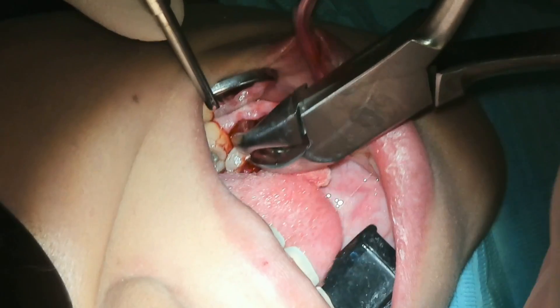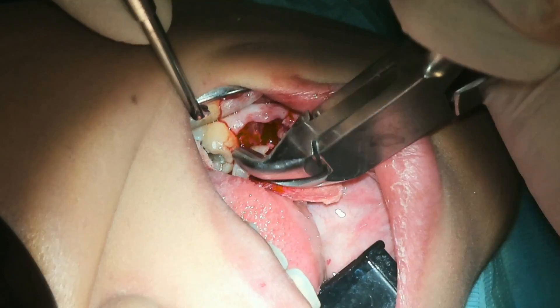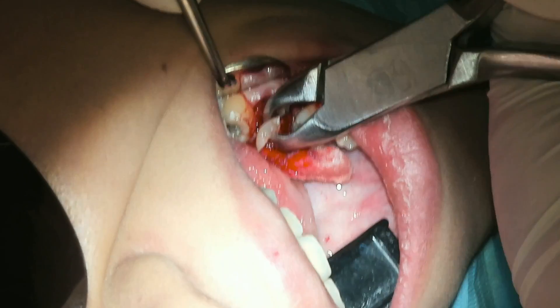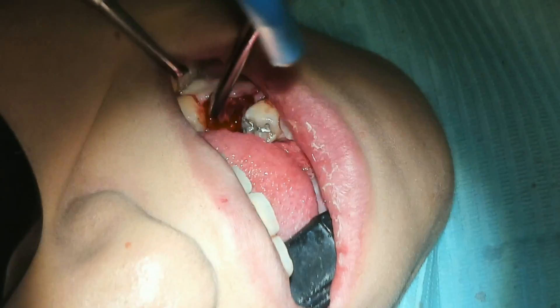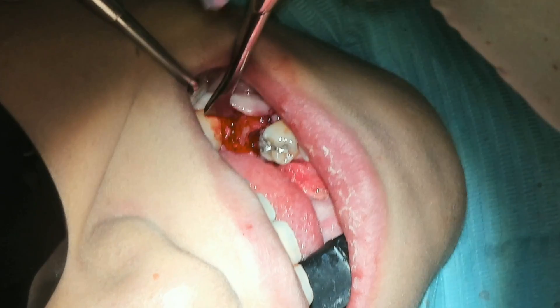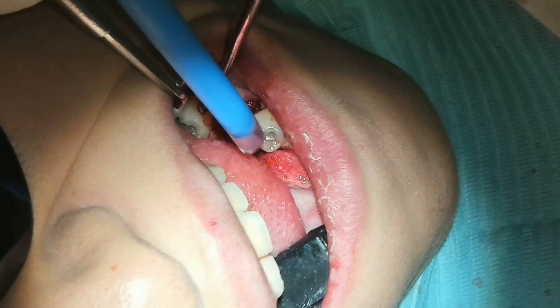In order to see a little bit better, I grab the rongeurs and remove the coronal aspect. This coronal aspect is not helping me whatsoever — it's just obscuring my view — so we move that out. Then we pull out the east-west and go ahead and elevate the distal root out.